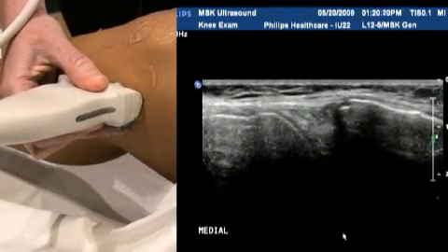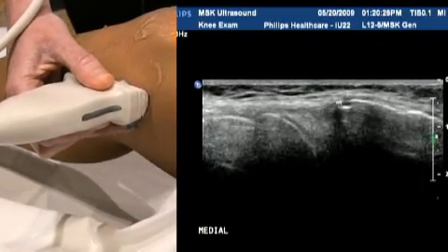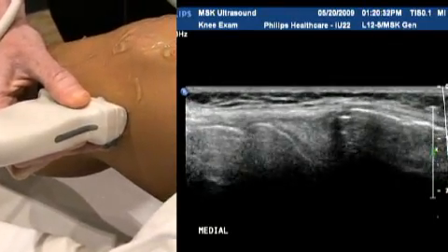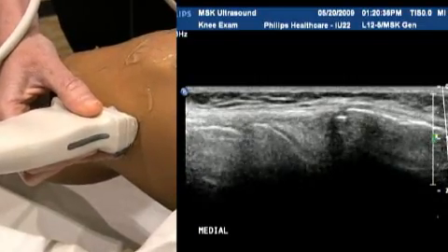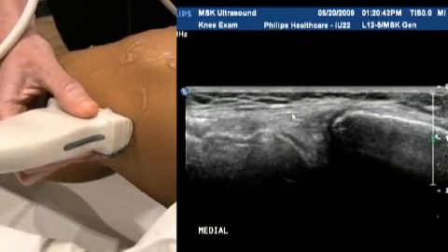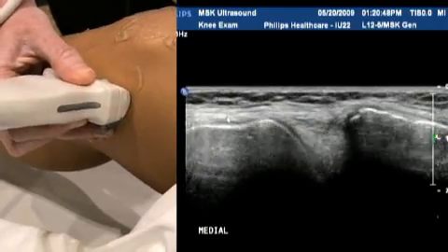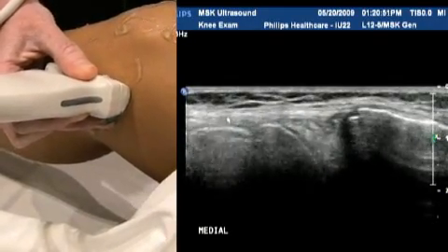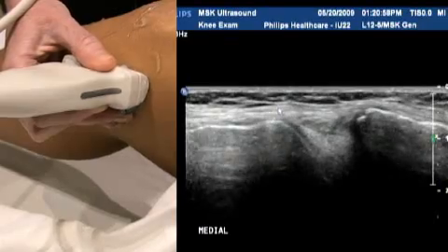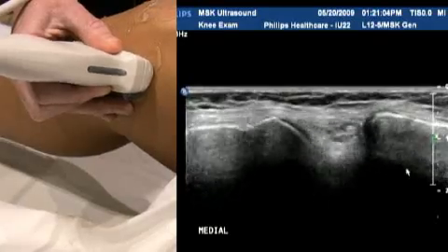The medial collateral ligament is a little easier to see on the medial side than the lateral. You can see a number of linear fibres running across here, attaching more proximally — that's the medial collateral ligament, the paired structure with the lateral collateral ligament on the other side. It should appear nice and thin and taut. You'll also notice the knee is slightly flexed for this part of the procedure.